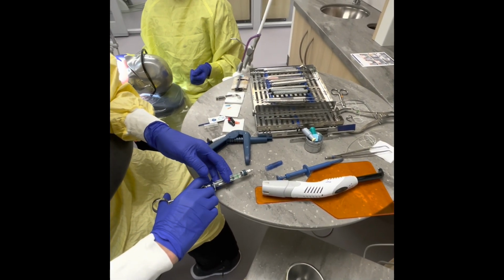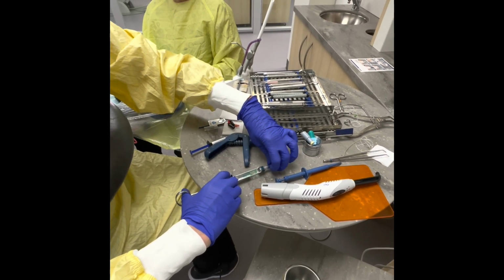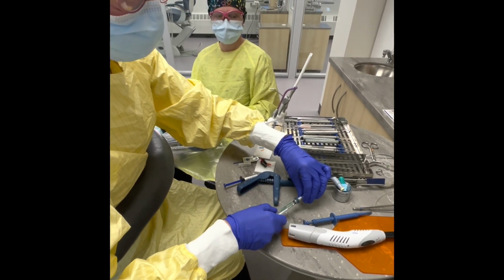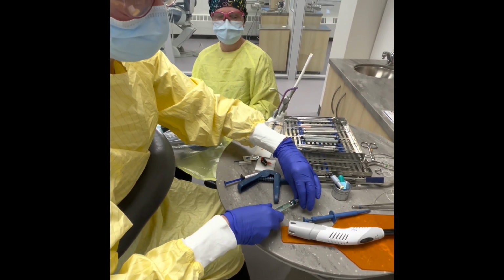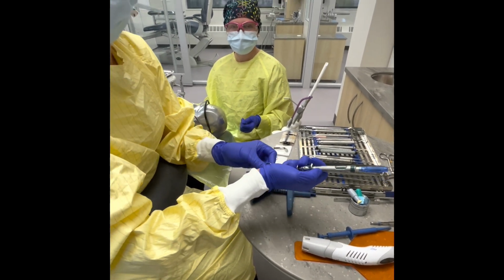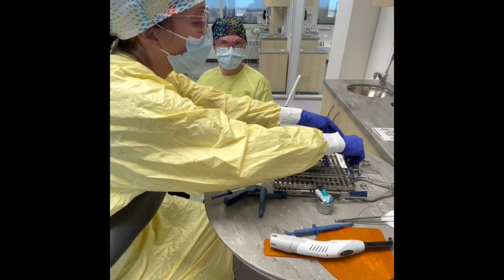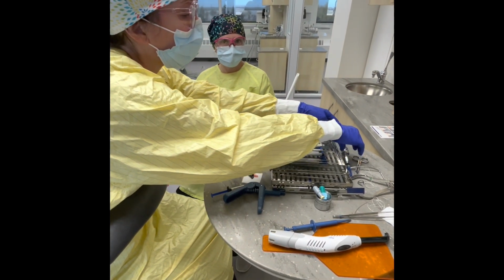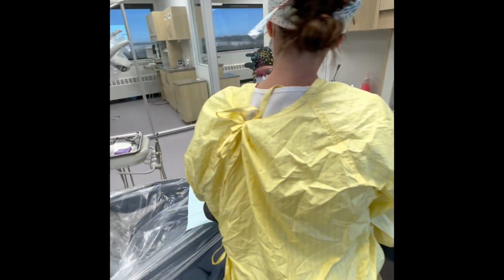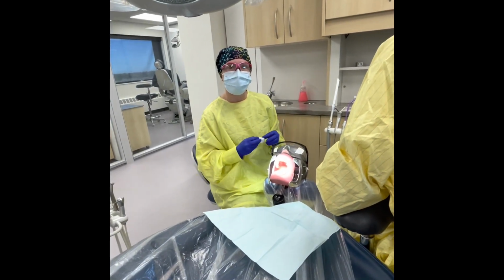When I recap it, I'm going to be very careful not to touch the counter with the needle. I'm going to recap it very carefully and make sure that this ring is on there tight so that when Amanda picks it up, it doesn't fall off. I'll then point the ring towards her so that she can access it safely. Thank you, Stacey. So the one thing that we're going to make sure you do is verbalize that expiry date for your operator. It's part of your safety requirements, so we're ensured that you've checked that, okay?